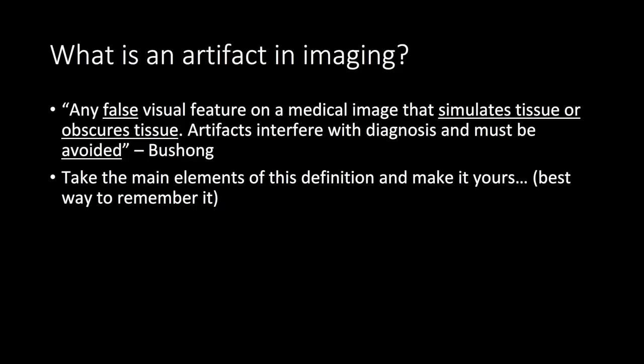Before discussing the different types of artifacts, let us define what an artifact is in our own words. For myself, I define an artifact as anything which doesn't belong or interferes with the diagnostic quality of an image and prevents the radiologist from giving a reading.